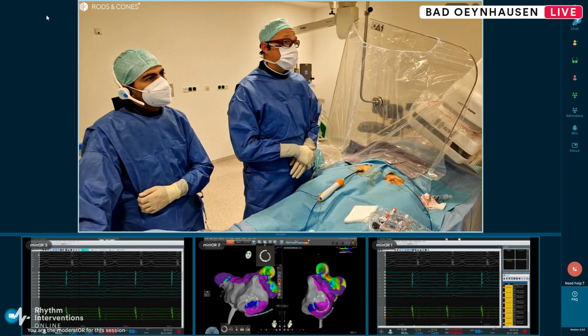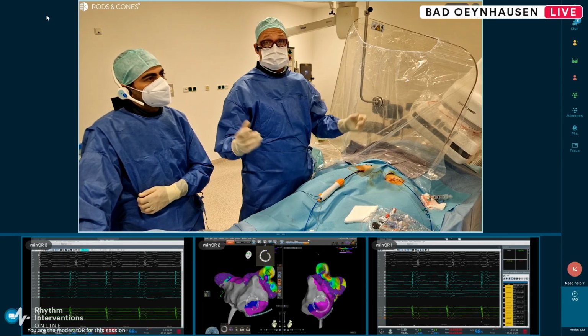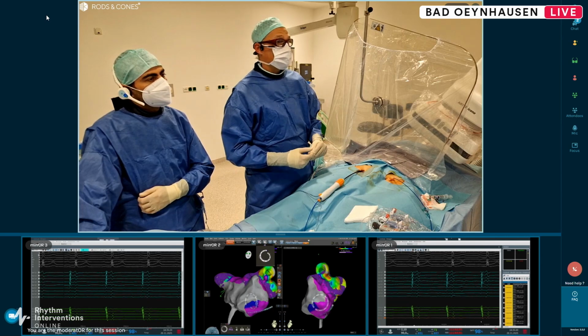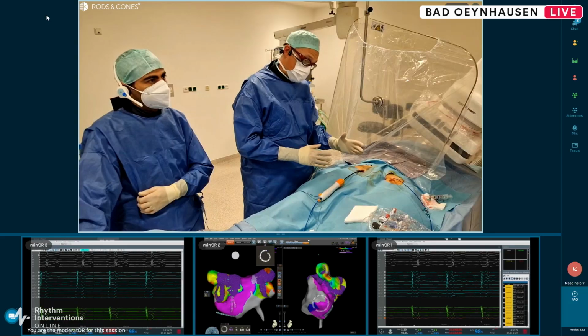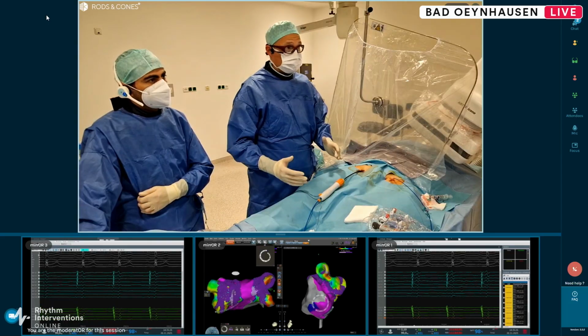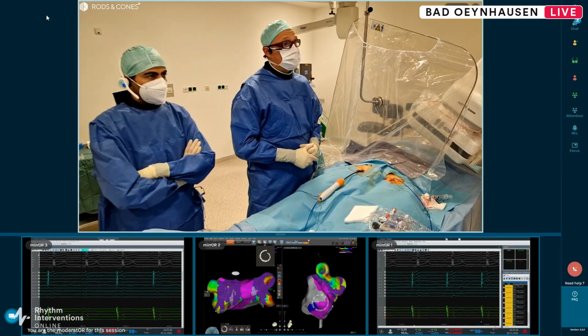And another important thing, and this is something we see from MRIs, we always do research about MRI in these patients. What we learned is that we also see different lesion formation using the different PFA technologies.